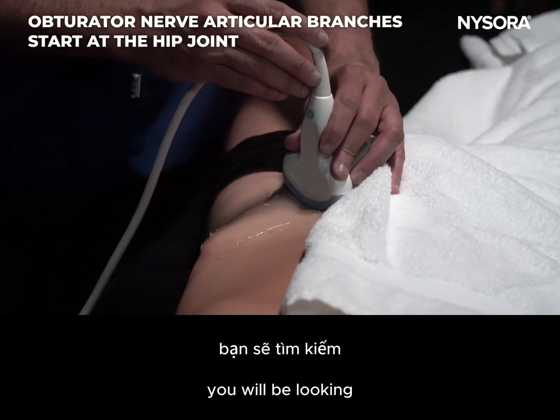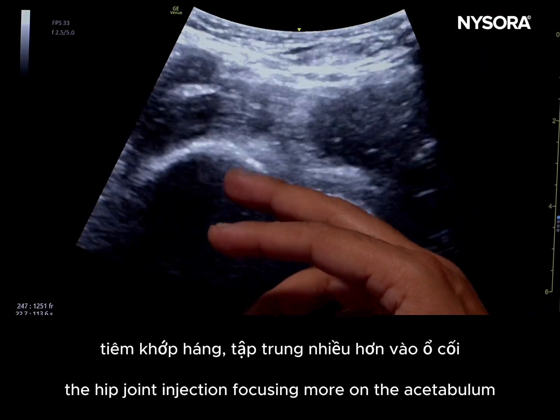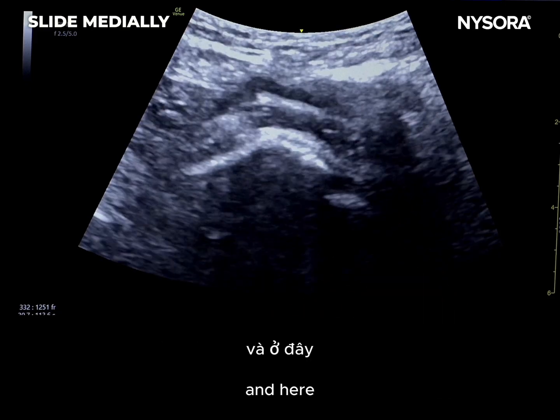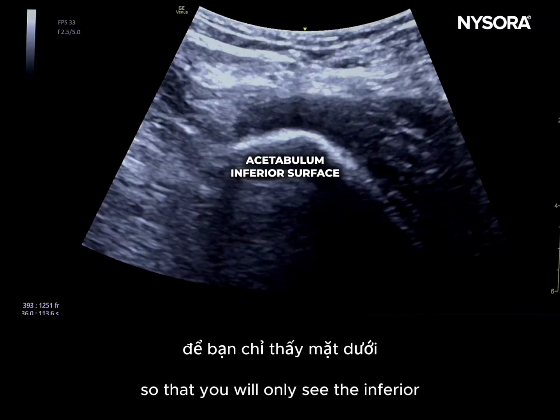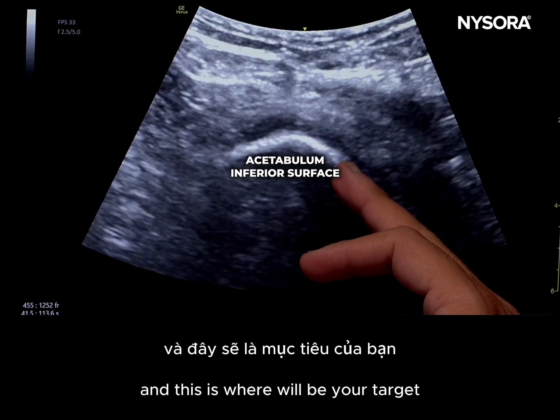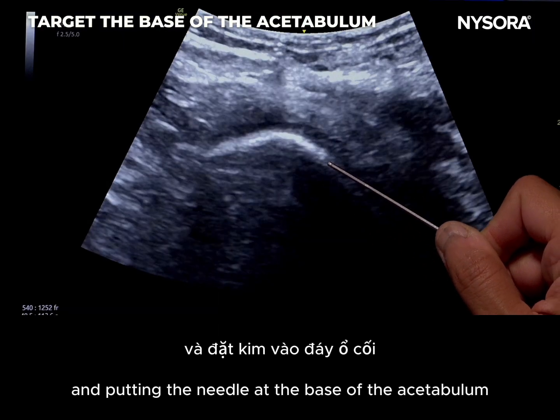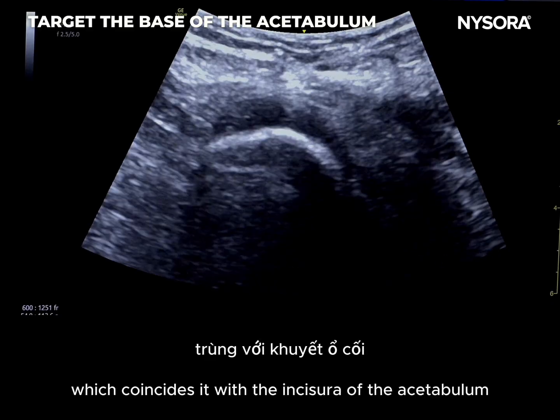To locate these, you will be looking for the image that we use to perform the hip joint injection, focusing more on the acetabulum. Once you see the acetabulum, you keep going medially, looking at the acetabulum, and here we will be moving the ultrasound probe medially so that you will only see the inferior surface of the acetabulum, and this is where your target will be, bringing the needle in plane from distal to proximal and putting the needle at the base of the acetabulum, which coincides with the incisura of the acetabulum.